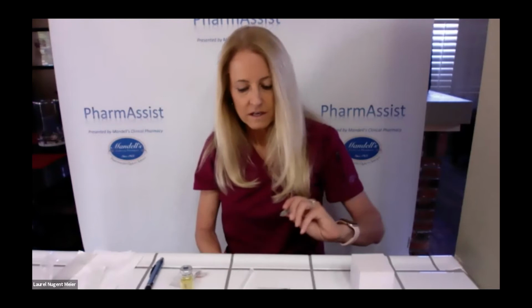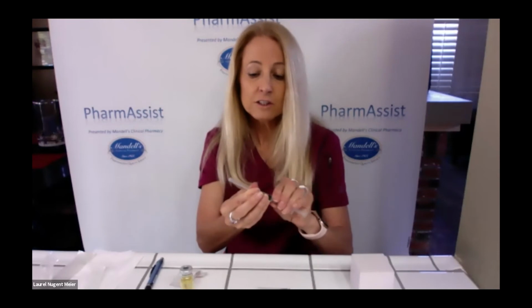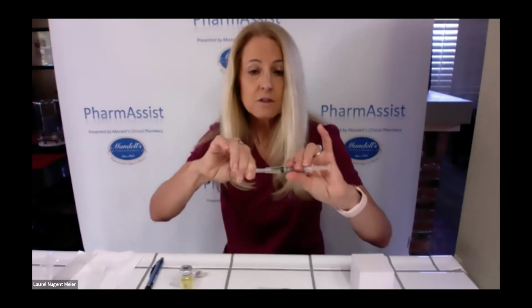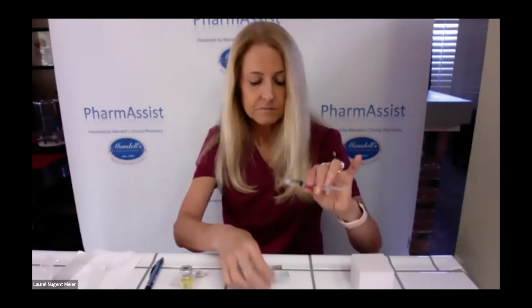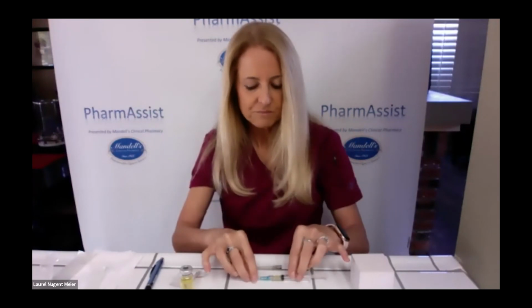So you take the cap on the counter and you just scoop it up and click. Now you're going to switch over to the give needle. So you twist it off, twist on your other needle. Now you're ready to give the shot.